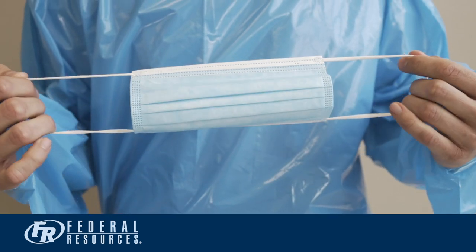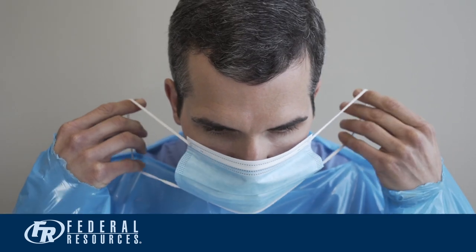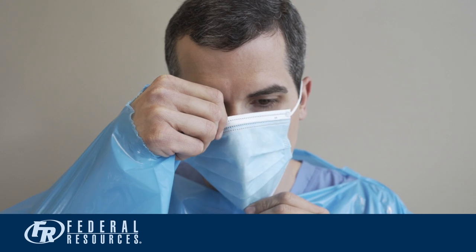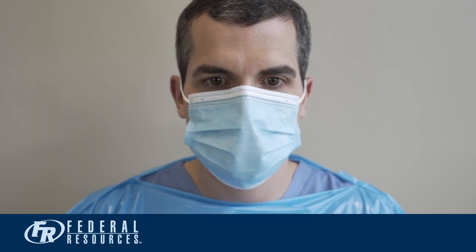The next step is to don your mask. Hold your mask by the elastic ear straps. Loop both ear straps around your ears. Once looped and secured around your ears, expand the mask to ensure both your nose and mouth are protected. Using your fingers, mold the mask around the bridge of your nose, down the side of your face.